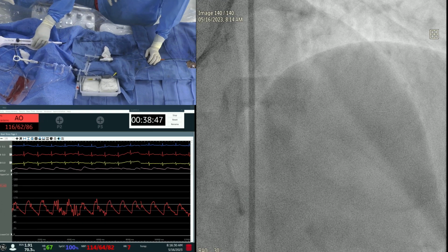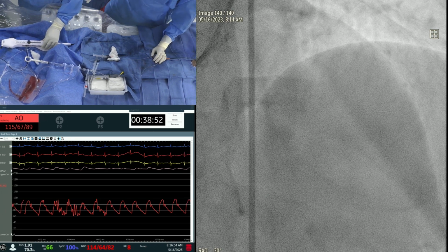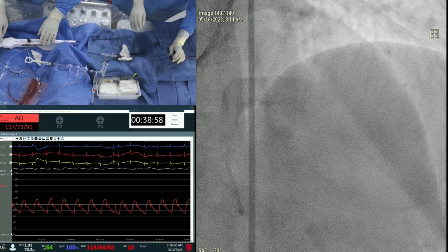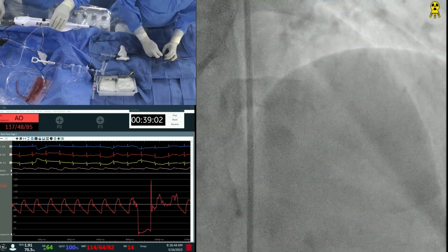Yeah, 3030. Yeah, good. Okay, let's go. We don't need to check it, we just go inside, as I said. No longer, because I had speed problems. Okay, so we are checking it. Fine, we are checking outside. About 160 is all set, and that's where we are.